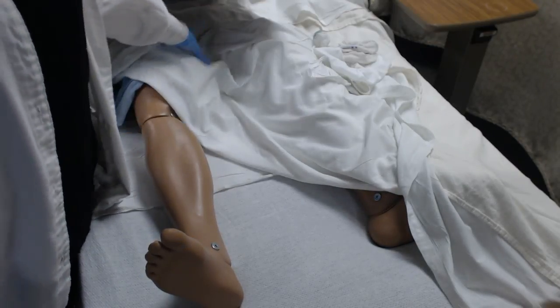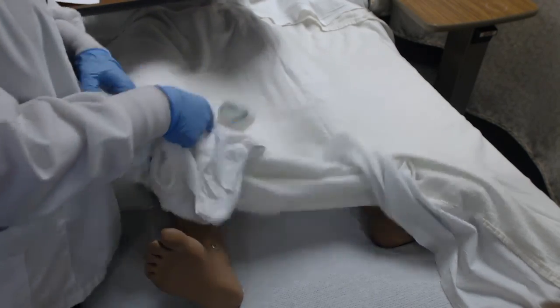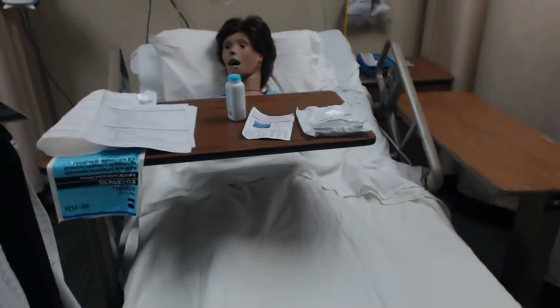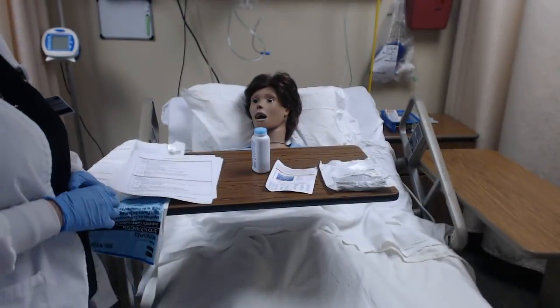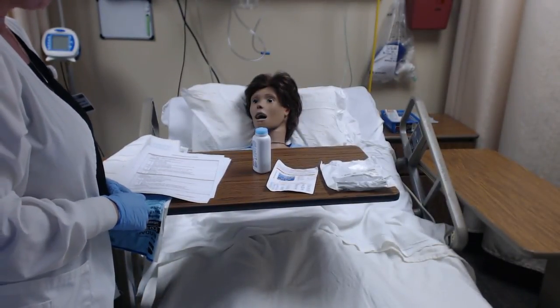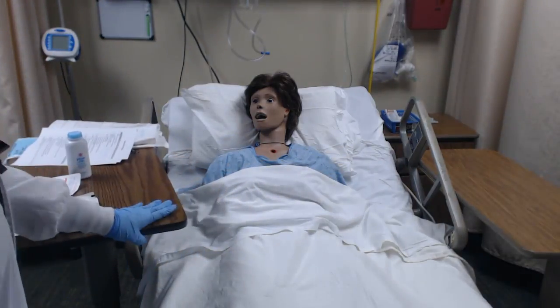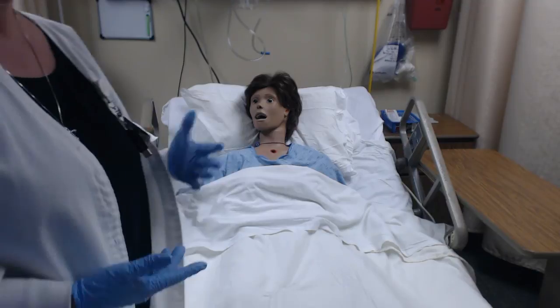Okay, finally I'm going to go ahead and leave my patient. Again, remembering my 3 safety pieces. I put her bed up, so I would then put her bed down, make sure she had her call light. I would then go ahead and ask her if she had or needed anything else. And then I would go ahead and leave the room. So you want to make sure your patient's safe before you go, and that they don't need anything else. And that is ACE wraps and compression devices.